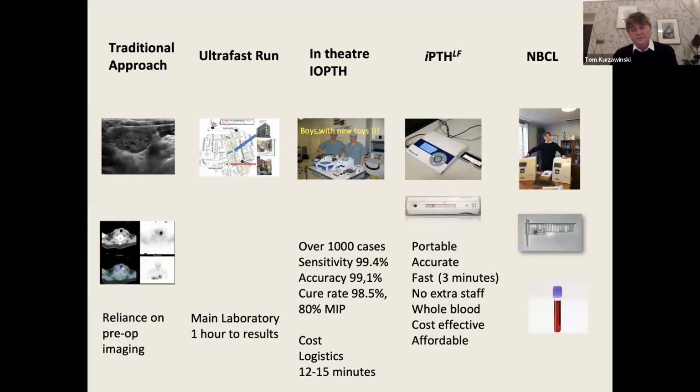And as I was working on the system, a new system arrived, and I'm not going to describe it in great detail because that is the next talk from the company. But it was quite an exciting time for me, because after all this work, suddenly we had boxes which could meet almost all of my criteria for the perfect IOPTH assay.